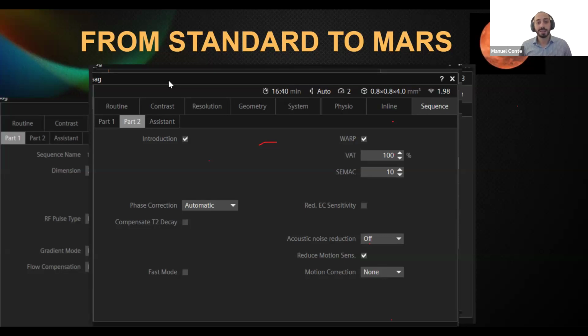Personally, with the scanner that we have in my clinic, I would scan the patient, because I think that I can get good images and I can check if there is an inflammation, infection or an abscess or synovitis around the metal implant. But obviously, it's good that you talk with your radiologist, and communication between the team is very important to take the best decision for the patient.